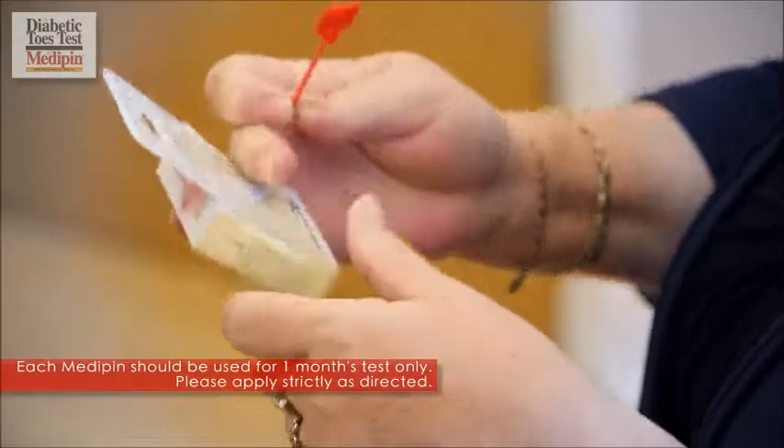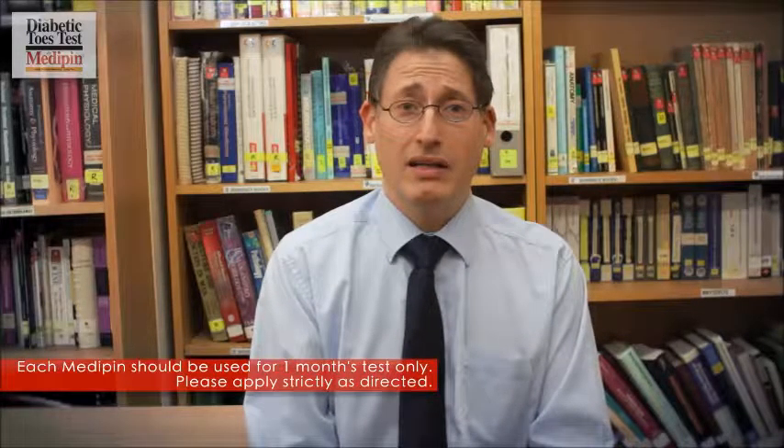Always remember though: don't ever use this test on an open wound or badly damaged skin.